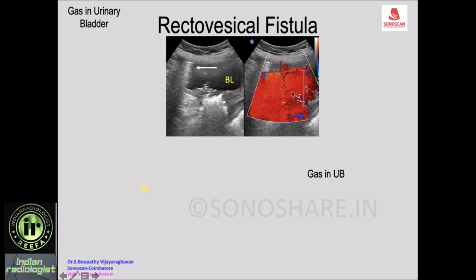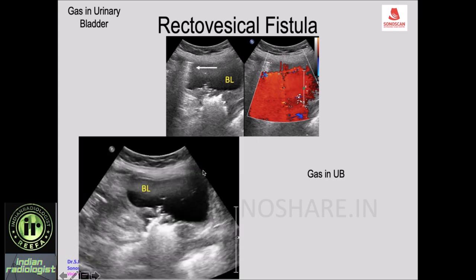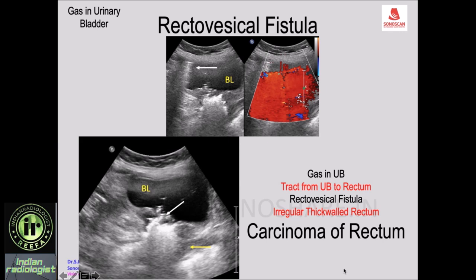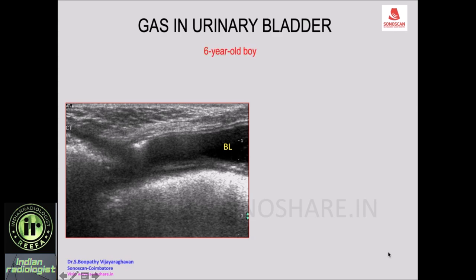Here again there is gas in the urinary bladder with the explosion sign and a tract from the bladder to the rectum, indicating a rectovesical fistula. On close inspection there is irregular thickening of the wall of the rectum — carcinoma of the rectum — which has infiltrated the posterior wall of the urinary bladder with a tract and escape of gas into the urinary bladder. This is a rectovesical fistula due to carcinoma of the rectum.